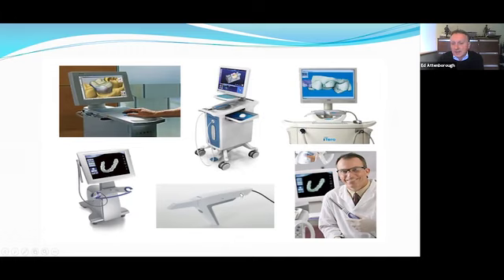So there's a laser or a projector in the handle of the device here, which projects light, either structured light or a laser beam, down the axis of the intraoral scanner wand. It's reflected off the mirror and onto the tooth or prep or the object that's being scanned. That reflects light back up, which is captured by the mirror and then reflected down back into the handle, where the stereoscopic cameras capture the image from two different angles and merge it back together.